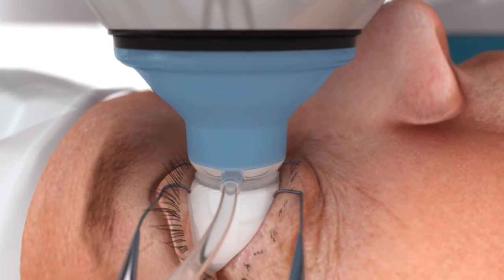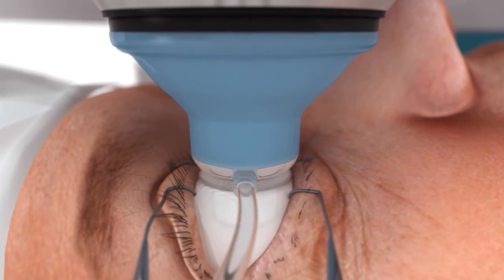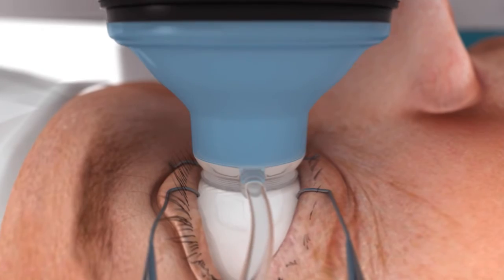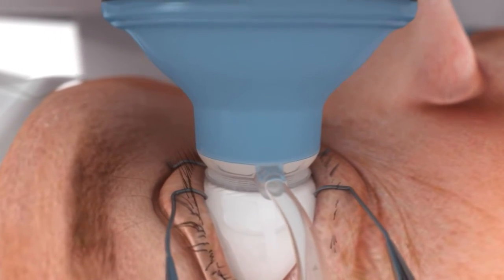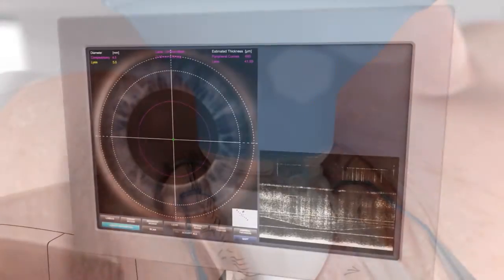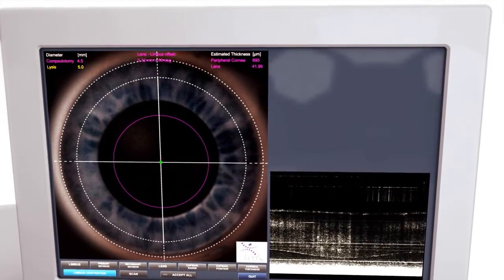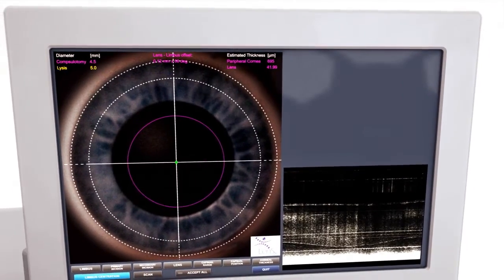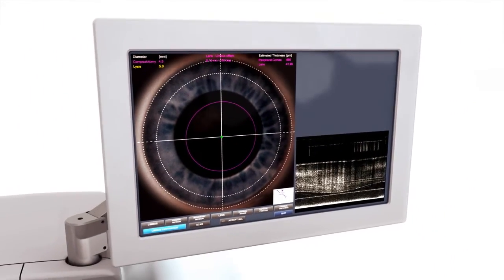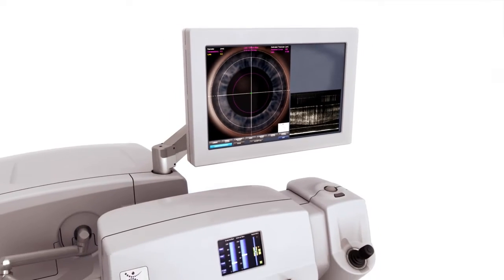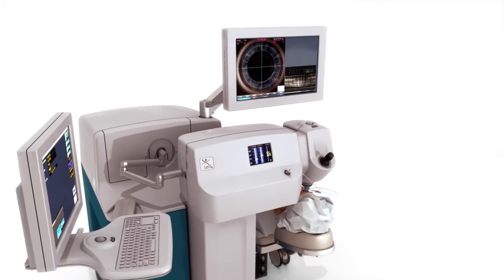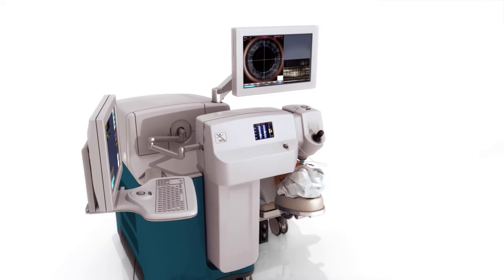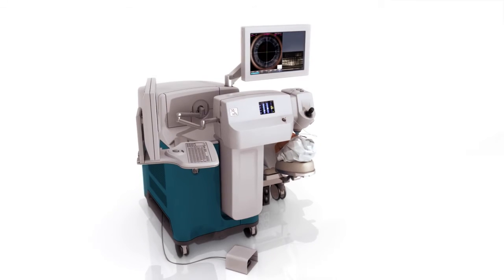The large-range OCT rapidly scans the entire anterior segment. This allows each step of the procedure to be easily planned, customized and executed. Scans of anterior and posterior capsules are efficiently captured, then presented as unrolled real-time images for precise programming.